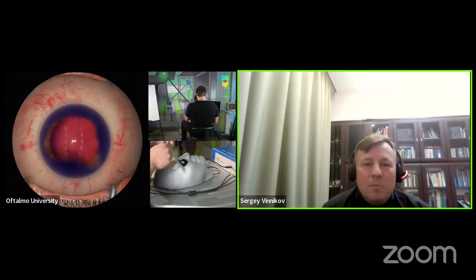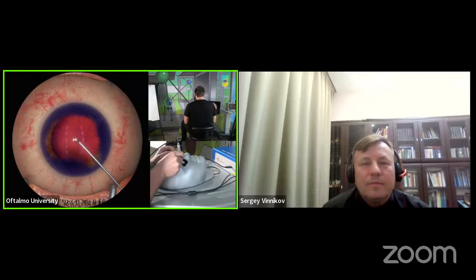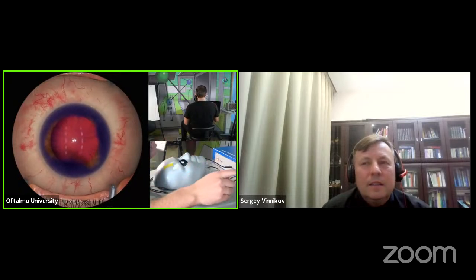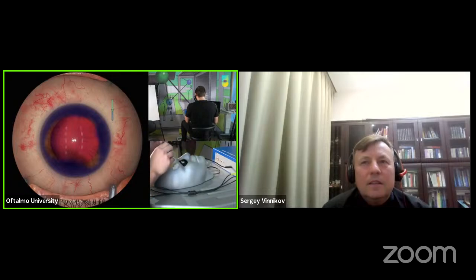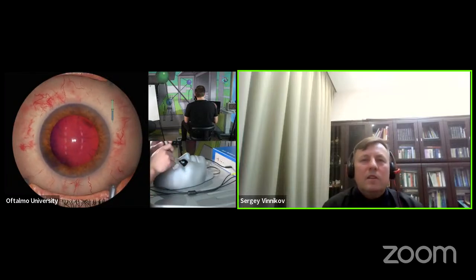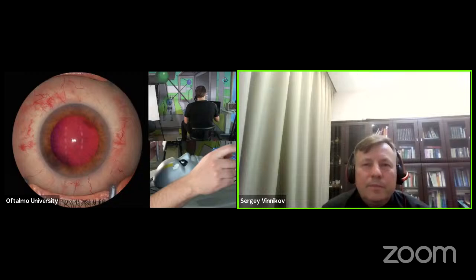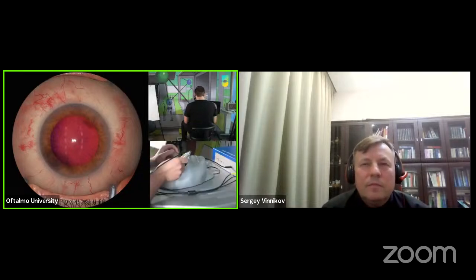Let's see what Andrew is going to do. Para, limpia más ese azul. Limpia bien ese azul. Le pusiste azul y le pusiste poco visco, claro. Sí, lo limpio. So, what Andrew is going to do, the first thing he did, he stained the capsule. Okay? And then what he wants is for that capsule tear to run to the periphery.